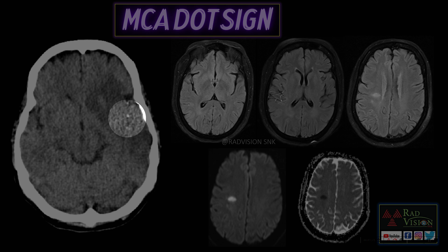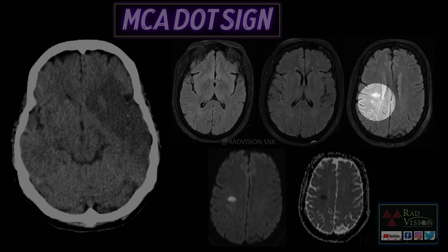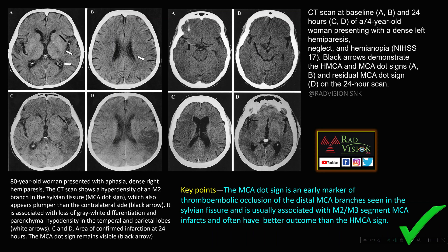Next is the MCA dot sign. Here you can see a hyperdense area noted within the sylvian fissure on the left side — the MCA dot sign — with infarct in the M2 segment of the left MCA. In another case, FLAIR hyperintense signal is noted in the M2 segment and cortical M3 branches of the MCA, with restricted diffusion and low ADC values. Whenever you see hyperintense areas in the MCA, search for infarcts in the M2 and M3 segments.